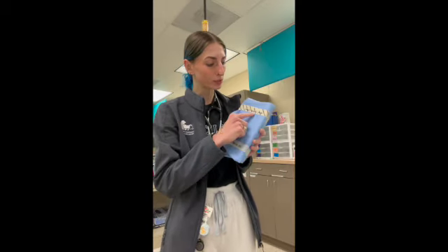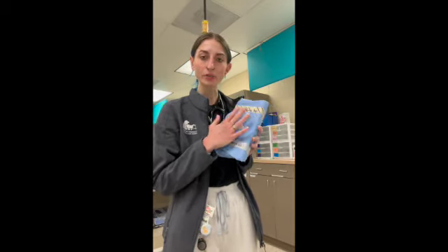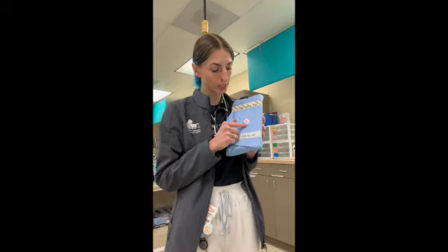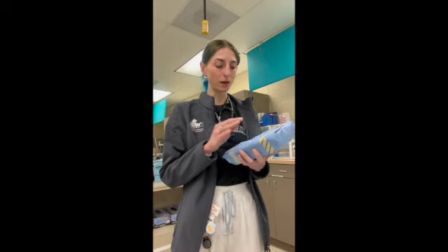So I now have our instrument pack back from our sterilization, and just to show you guys, we now have the black stripes on our tape, and that is going to show us that this passed our steam sterilization. And then we also just have little stickers that our OR team puts on here, to say that it has been sterilized and it has the date and the time. And so that is on there. We have our black stripes to prove that it has been sterilized appropriately. And so this would pass the sterilization.